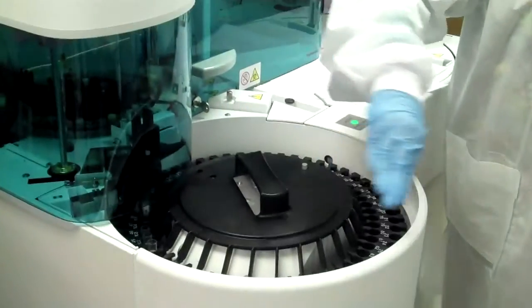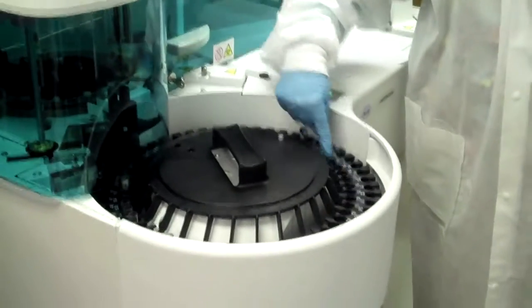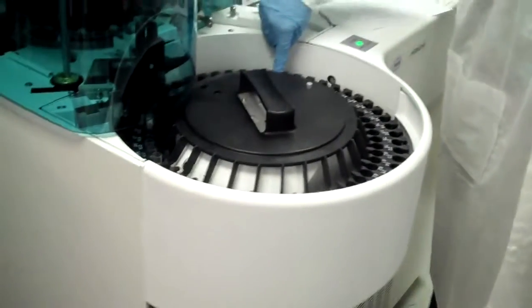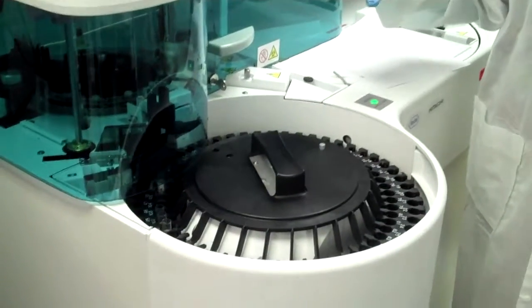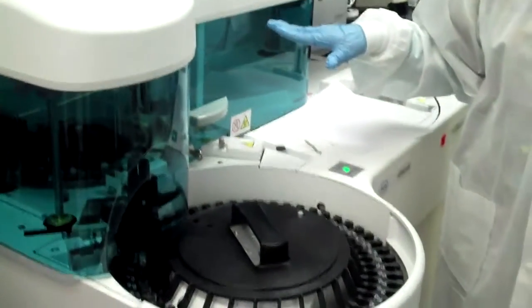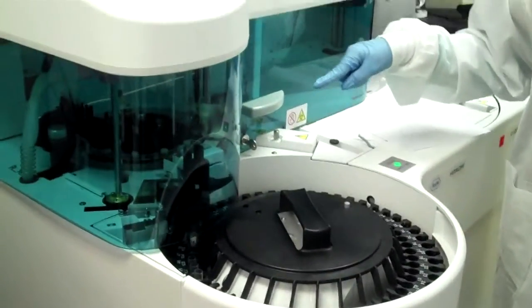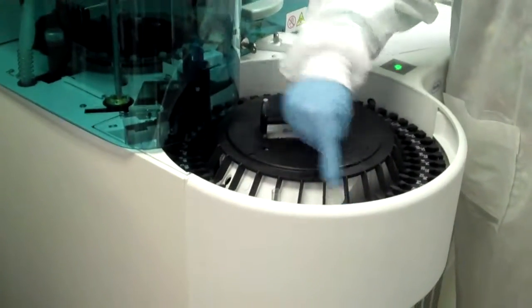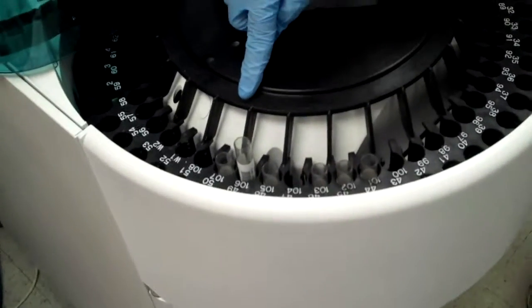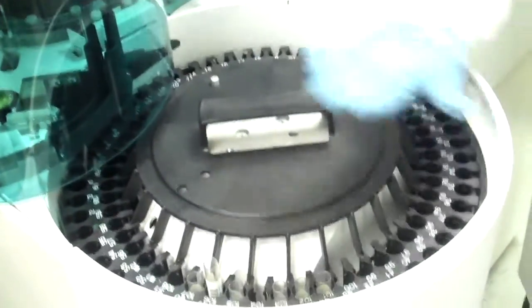Side positions are designated as routine. Okay. And some of these inner positions are reserved for calibrators, controls, materials that are used just to maintain the instrument and check that it's working properly. And certain of the positions are for stat patients. On this particular one, sections 101 through 108 are our stat positions. And anytime you put anything into those positions, it knows to give that priority, just based on the position.